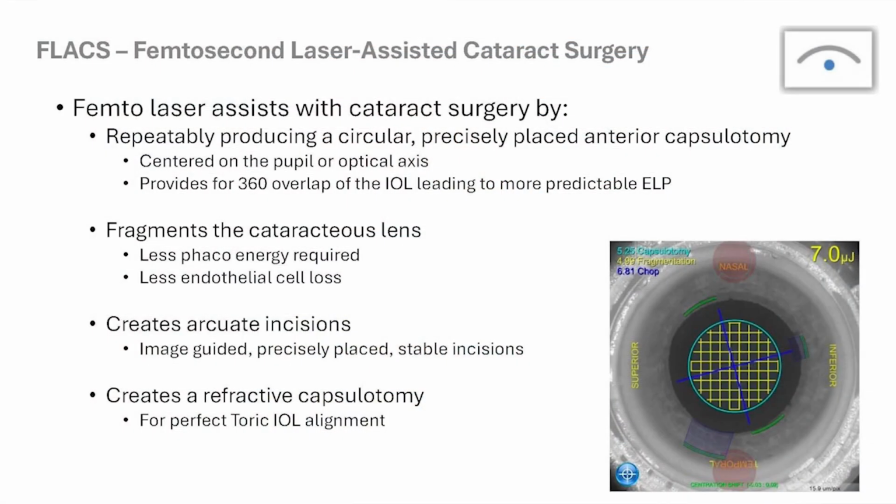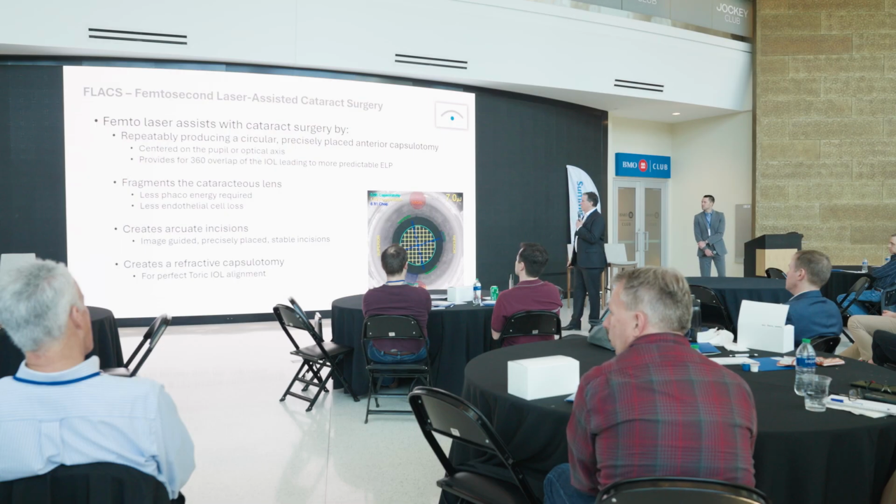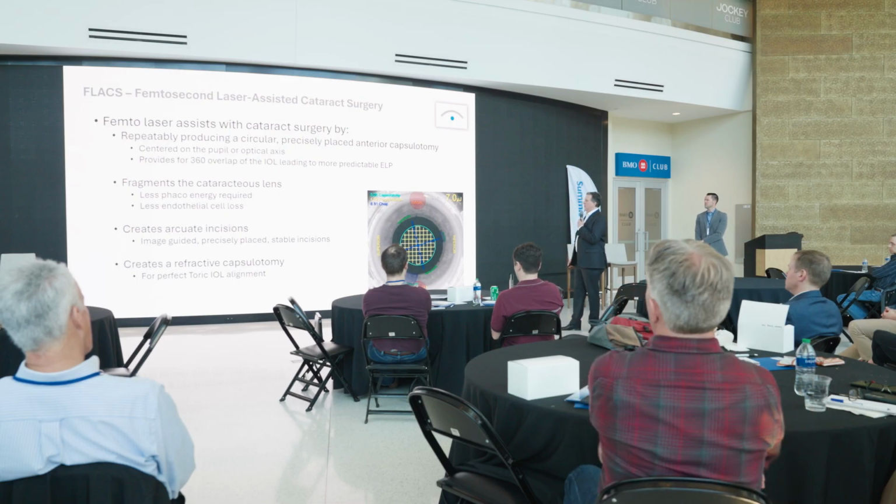So we're here to talk about FLACS, which stands for Femtosecond Laser Assisted Cataract Surgery. And really what this does is it improves the steps of the surgery that we used to do by hand and creates a more consistent outcome. We want to optimize the position of the implant, and that means effective lens position. We have a more accurate correction of the overall power of the lens for where it sits, actually vertexing, you can think of it that way. We want to be able to treat the astigmatic correction, and to a lesser degree it fragments the lens. But let's go through some of this one step at a time.